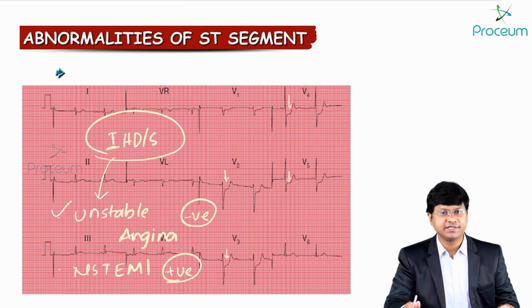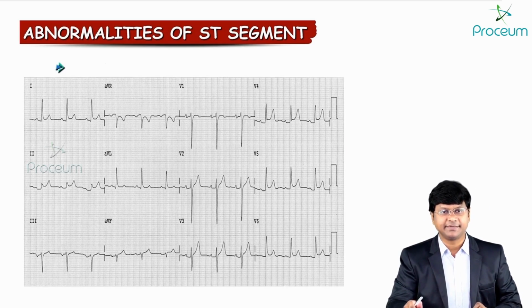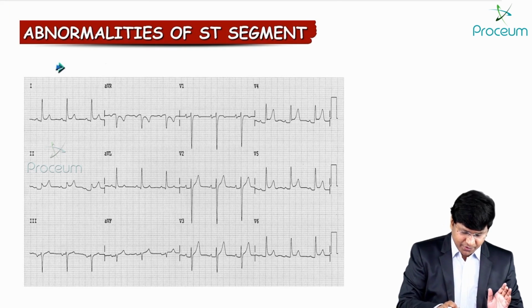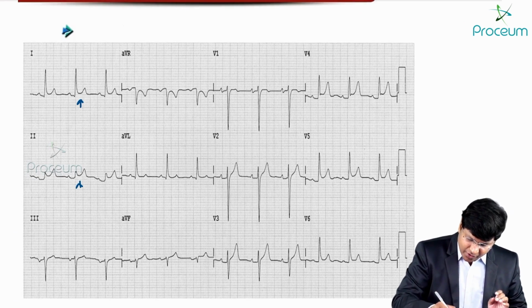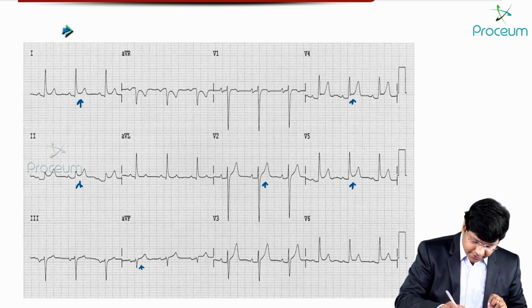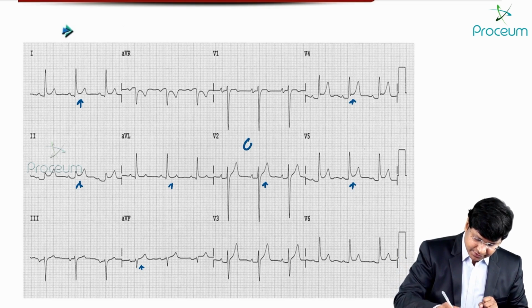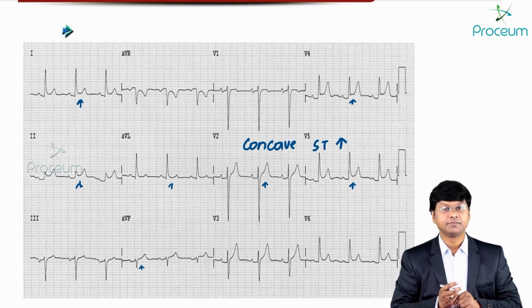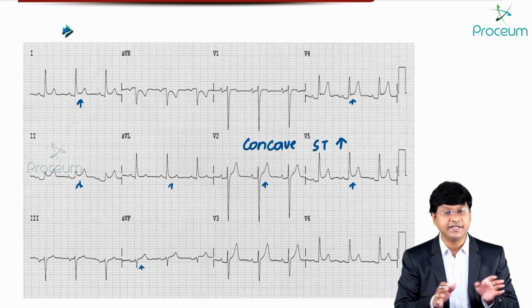Now let me show you one more ECG. If you see this ECG, what are you observing? Directly concentrate on the ST segment. In this ECG, you can observe the presence of ST segment elevation in almost all the leads. And how is the shape of that ST segment elevation? It is a concave ST segment elevation in all the leads diffusely.